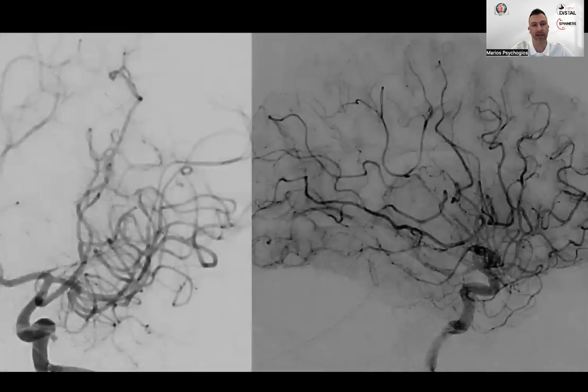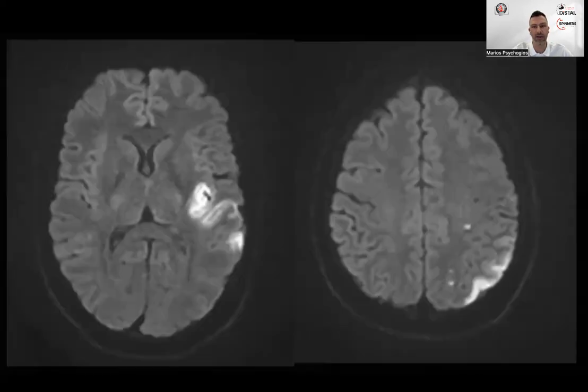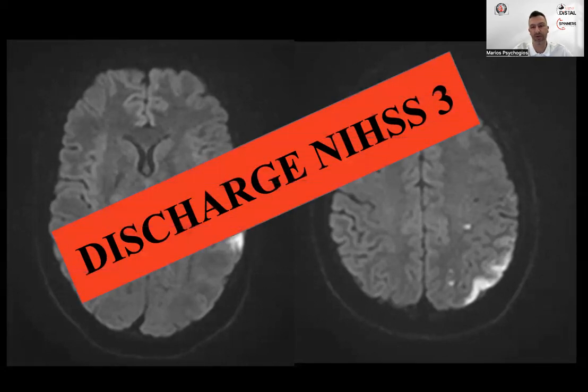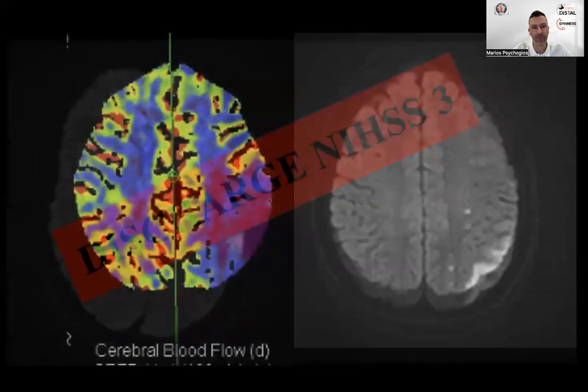And this was the result in this case. You can see we have, after 1 pass, recanalization of the vessel. We have some small spasm here, but overall good reperfusion. And then you can see the day 1 DWI here, where we have some DWI lesions, primarily on the cortex, but this whole large lesion that we saw initially on perfusion is not there. So we definitely could save some brain, and the discharge NIHSS here was 3.